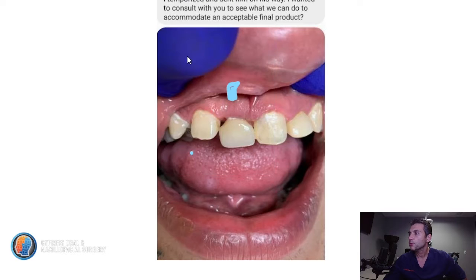he didn't have a temporary tooth, so the laboratory had no way to figure out how to make this abutment. So they just made a straight abutment, which looks like this and like this, and then the crown looked like a lollipop. You know, there's big overhangs. It just was terrible. And so ideally what you want is you want the crown to look like this, smooth and kind of flow out like that.